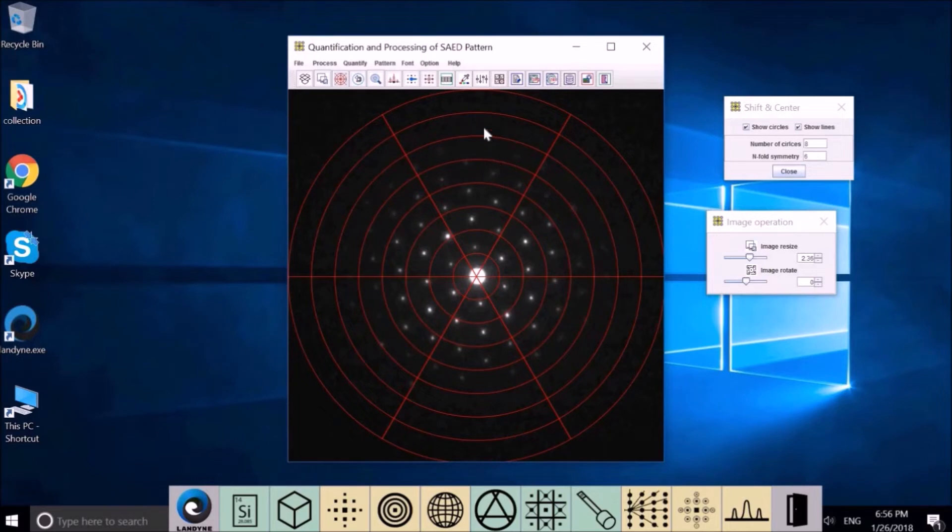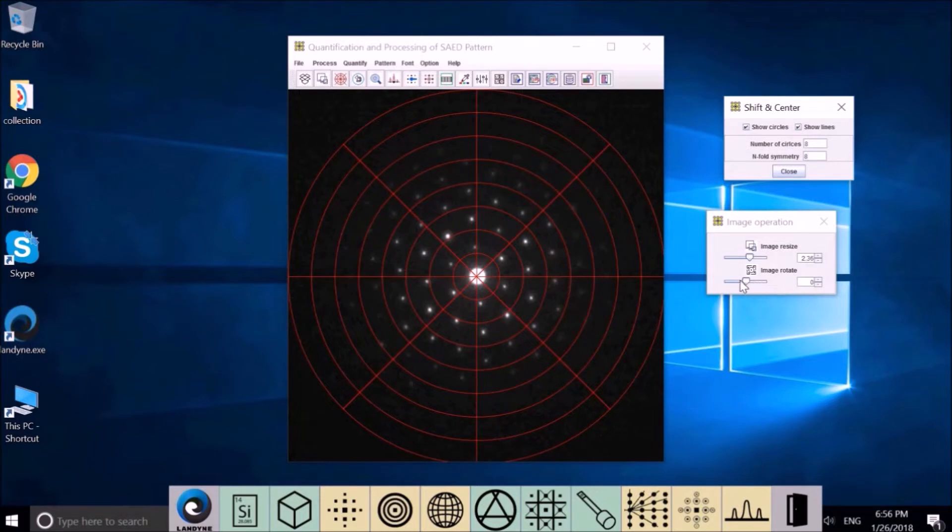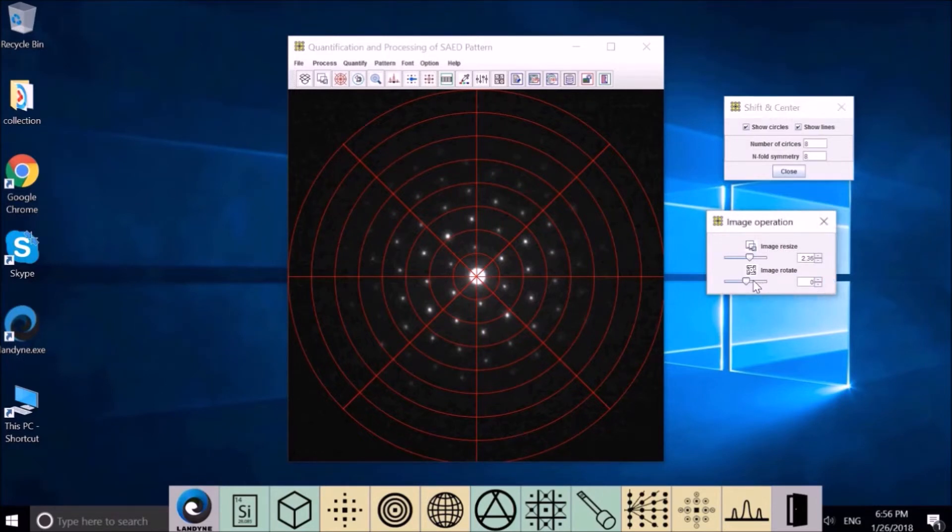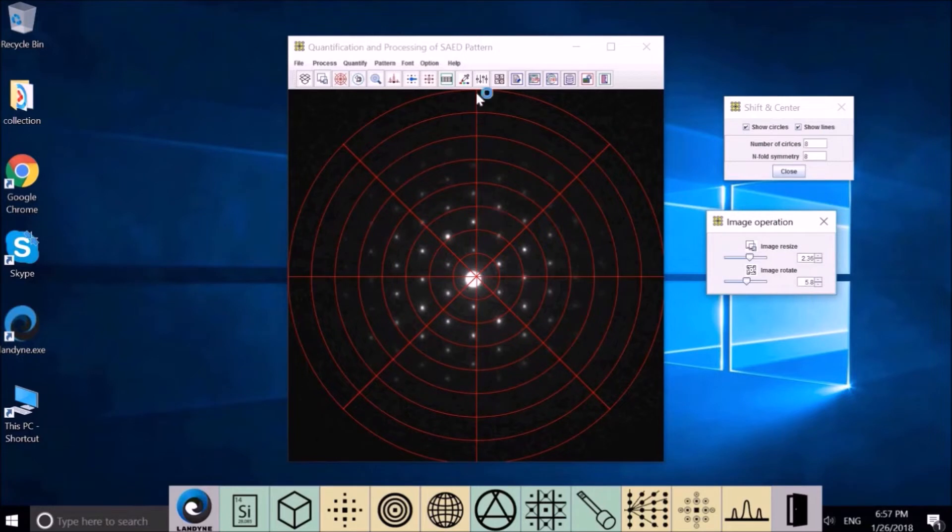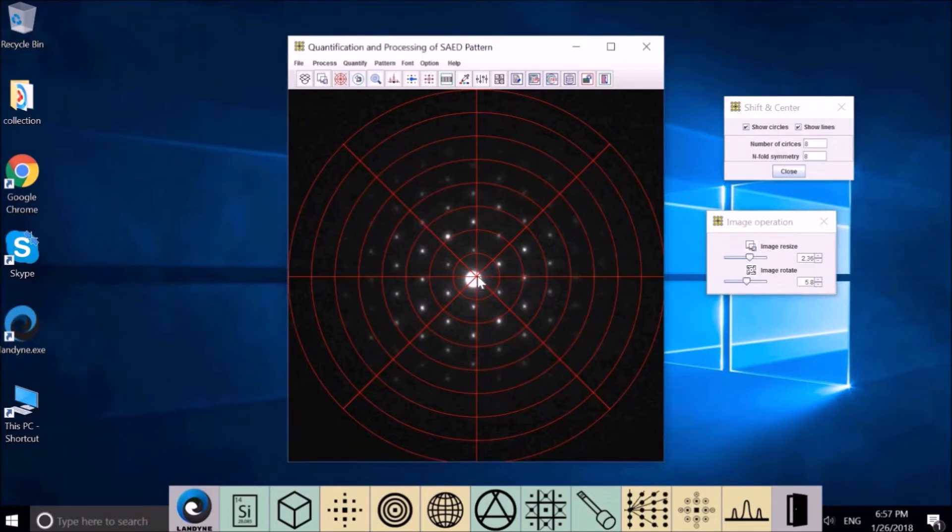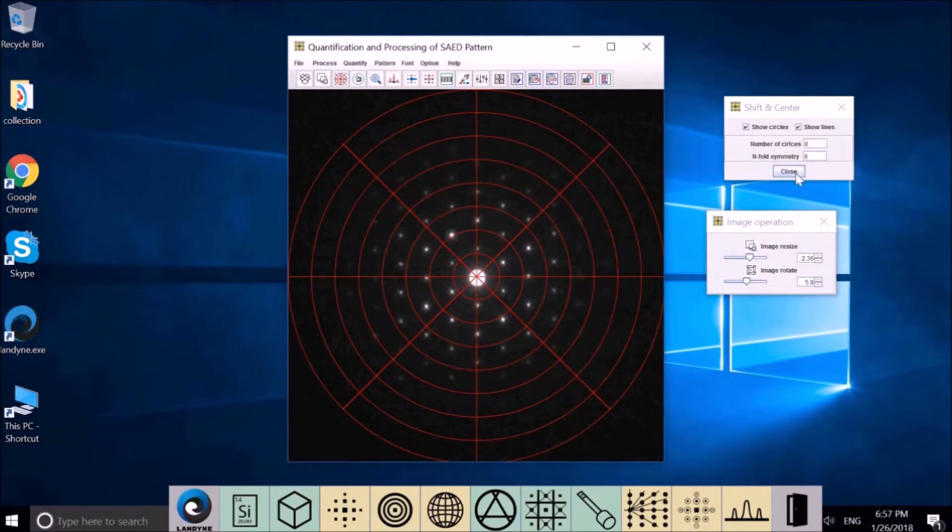To rotate, we want to make a guideline here, so we may choose eight. Either slide this or use the number here. And now see the vertical line is parallel to this vertical line. Readjust the beam center. The pattern is aligned and resized and rotated.